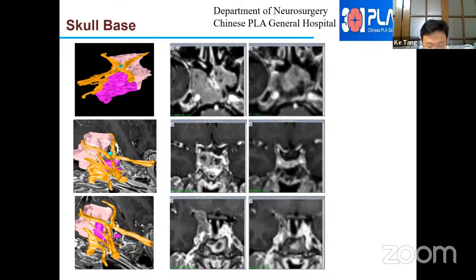The imaging of T1-weighted sequences and T2 SPACE sequences showed the cisternal segments of cranial nerves. The TOF sequences showed the artery. The high signal of contrast enhanced T1-weighted sequences was used to show the vein, and the cavernous sinus segment of cranial nerves was shown as lower signal on the background of high signal of vein.